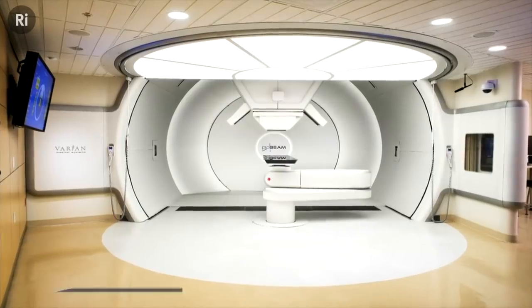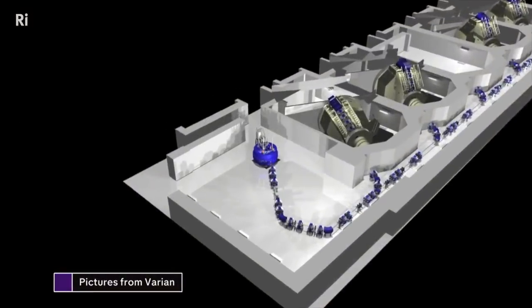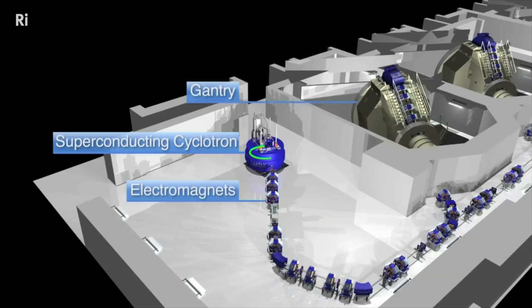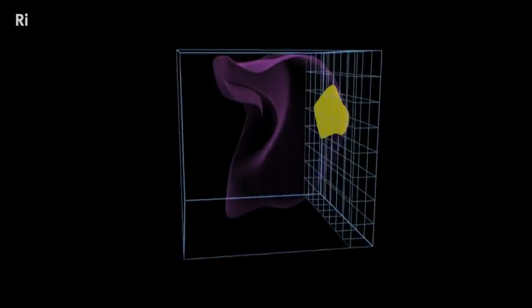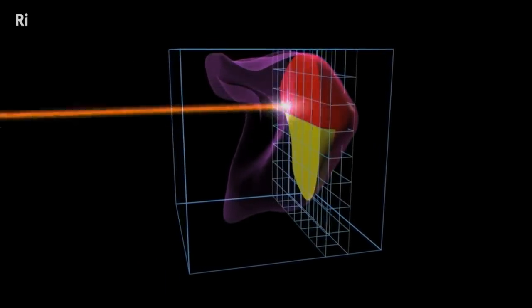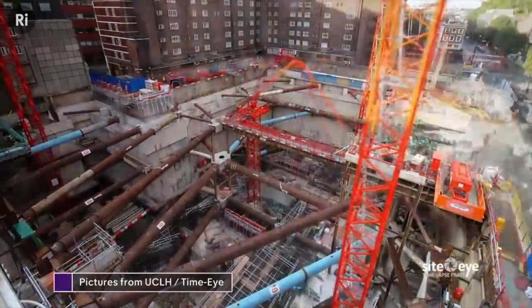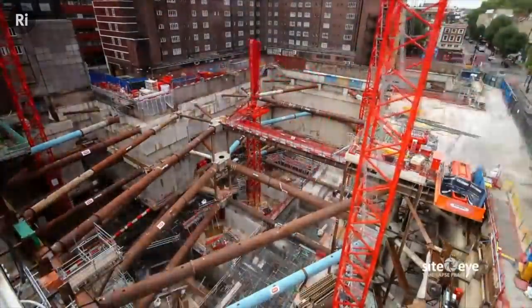And when it's completed, this is what the proton centre will look like. Four treatment pods. The protons generated by a cyclotron that moves at 2/3 the speed of light. The proton beam is carried along huge magnets to the patient. Instead of conventional radiotherapy, this beam uses small parts of atoms, the protons, which leave surrounding organs and tissues undamaged. The NHS's first patients will be treated at Manchester's Christie Hospital this autumn, and this complex in central London will come on stream in 2020.